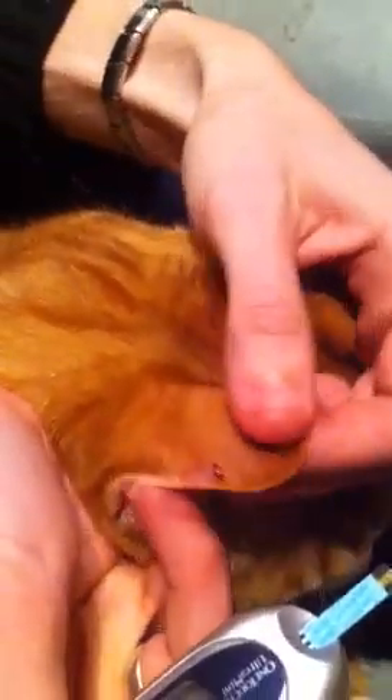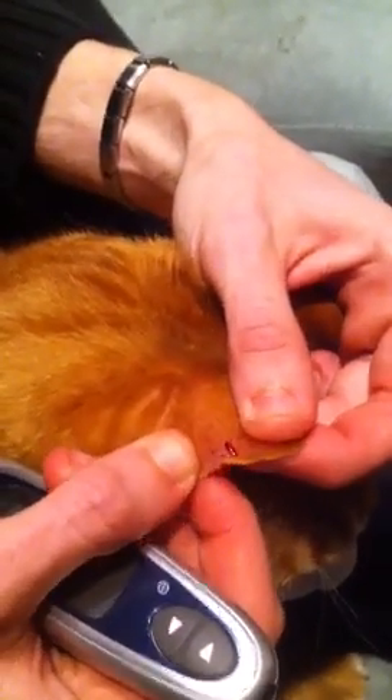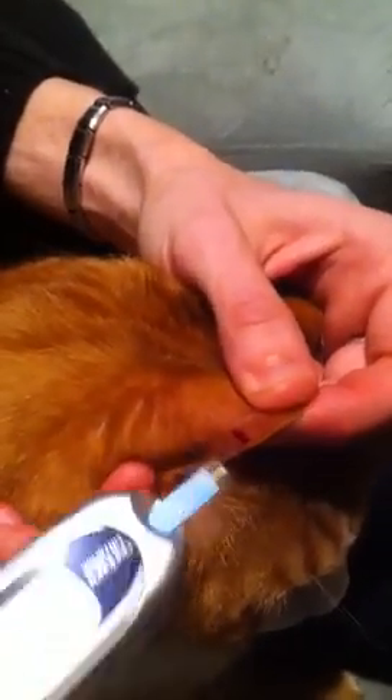I slide my strip into my glucometer. You may want to slide your strip in first if your cat's a little jumpy. Calvin's really good for us — we knew we were going to talk a while, so we didn't have the glucometer turned on yet, but you probably want to have that ready first.